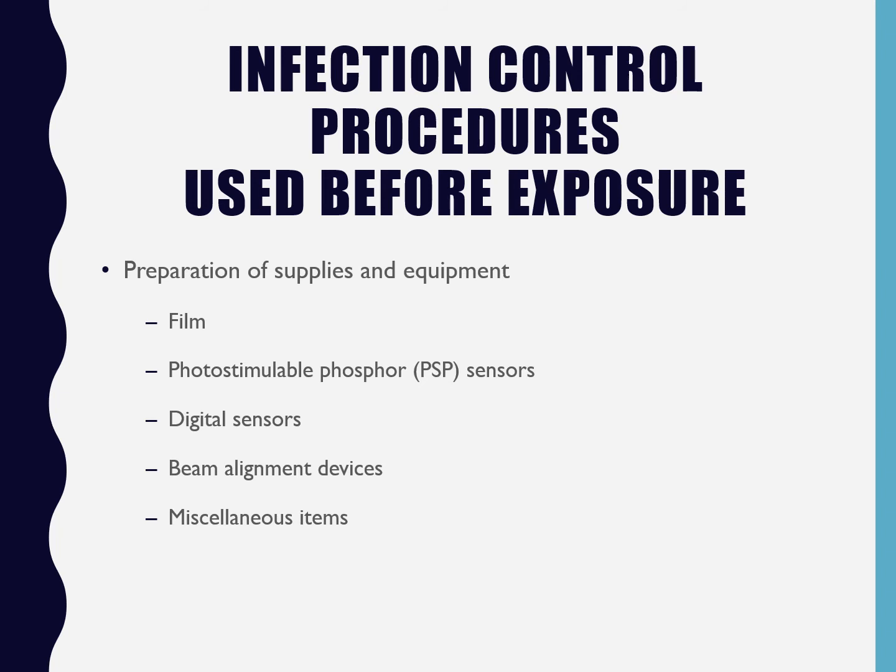We want to have our beam alignment devices out. So it would be inappropriate for you to seat your patient and then walk into sterilization to get your packet, right? So I want you to have your beam alignment devices out on the counter. Also, the miscellaneous items here refer to our patient's items.